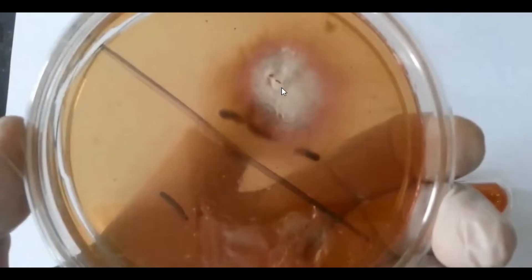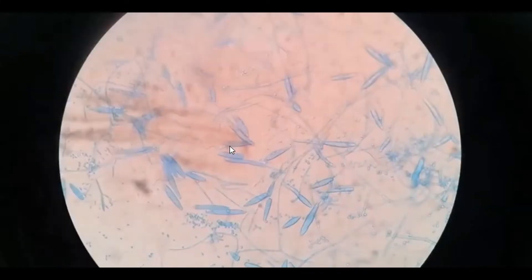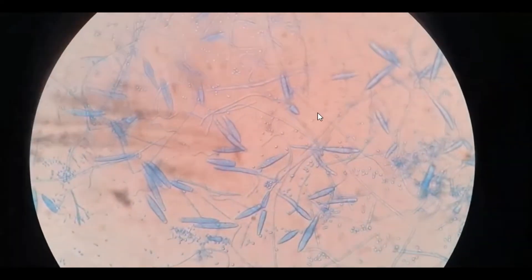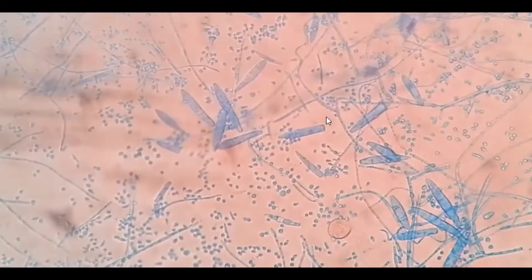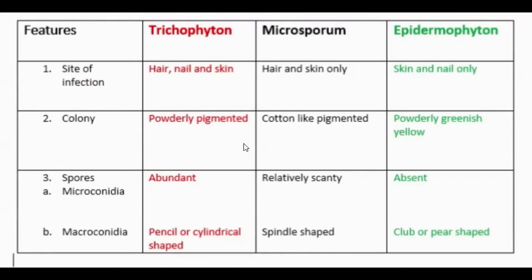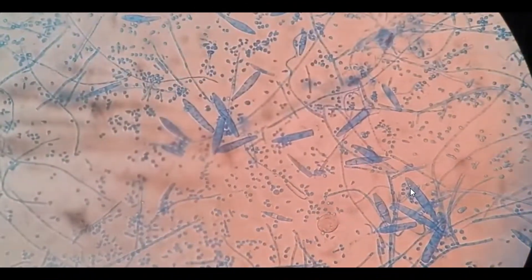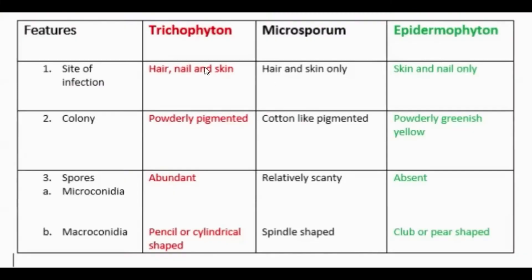Let's watch the clip. Here you can see powdery pigmented colonies, and here you can see abundant microconidia — many microconidia in this field. And about macroconidia — pencil or cylindrical shape — here you can see pencil shape. So the organism is Trichophyton.